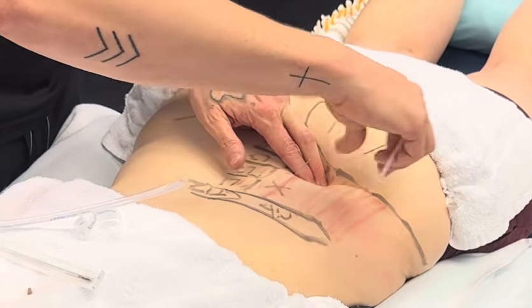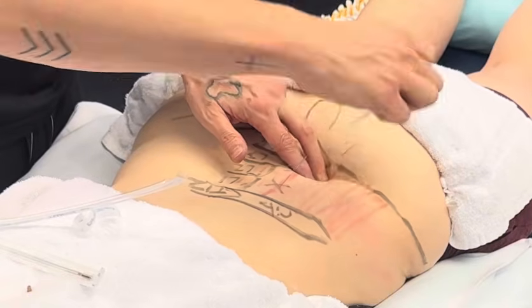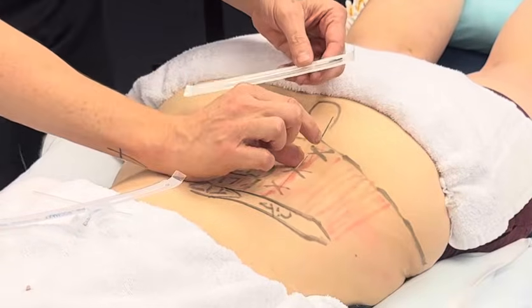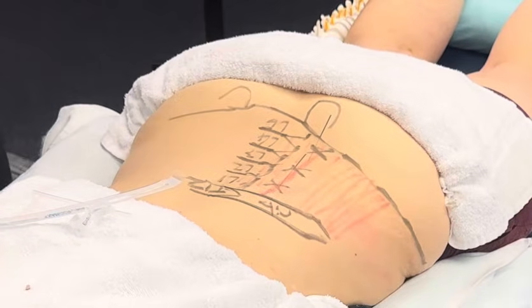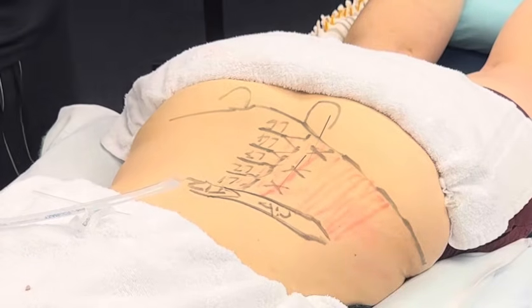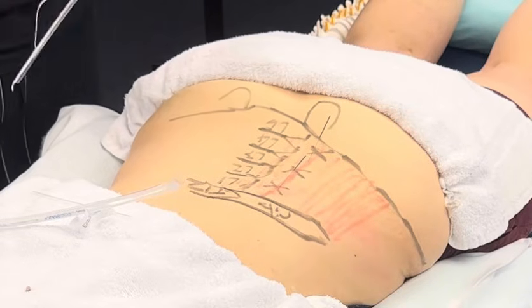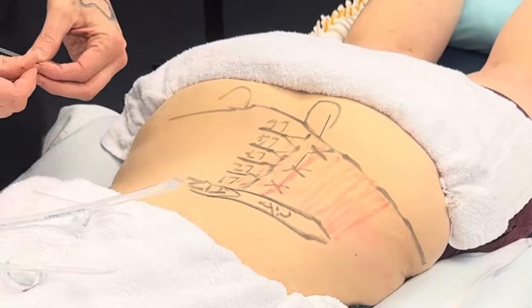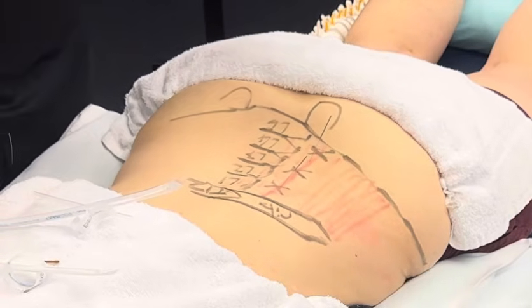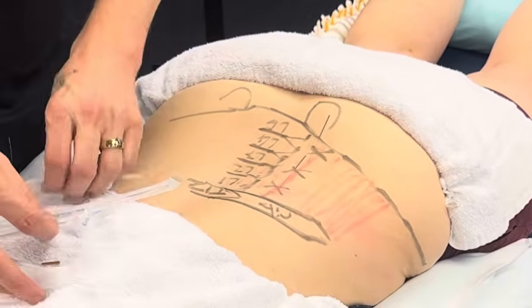End of the paraspinal muscle bulk, about 60 degrees from the vertical. There's the bone. Is that pretty wild, y'all? Yeah. So we've got like 3 inches. We're like 3 inches in. So you'll be surprised, right? Especially if you're going at an angle, Pythagoras theorem, and all that stuff. It's a negative slope. We never escape math and physics, right? We just think, man, finally physics is over. It's never over. It just follows you.